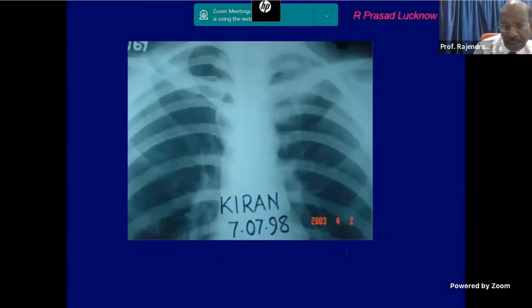And then I'll start with one example. This lady, I saw her in 98 when I was head at KGMC. She came into my room weeping. I said, why are you weeping? What is the issue? So she said, sir, I have no problem, but somebody has started anti-TB drugs. If you see very clearly, there is definitely a shadow in the left upper zone. And that was the reason why somebody had started. And you also see there is some rotation, left anterior oblique rotation.